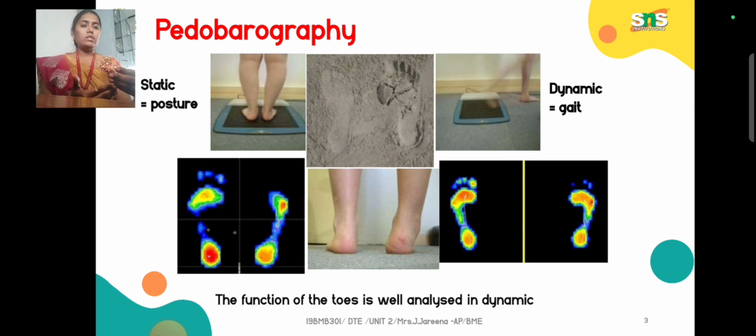When you are placing your foot on the land while walking, we look at how the pressure differs and how the force acts on the ground. If you are maintaining a proper posture, the force will be spread all over the foot, so you can tell the patient has a proper gait cycle, and in later days you won't have problems related to posture, leg pain or joint pain.